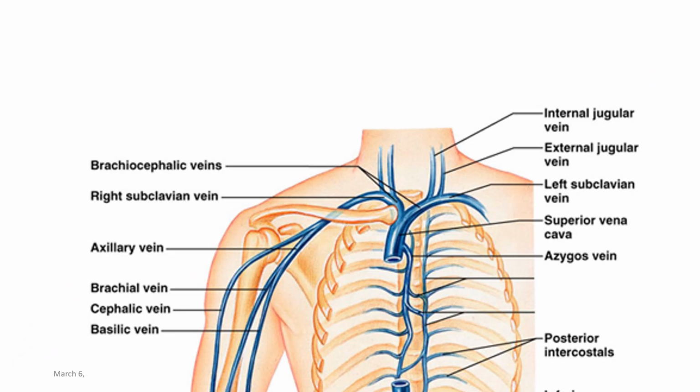Okay, now once you're done with your internal jugular vein, some site protocols will require you to also demonstrate the external jugular vein. This is a smaller vein to the lateral of your internal jugular. It doesn't fill as much, so it can be a little bit more difficult to identify, but you'd want to evaluate that external jugular vein in the same manner you did with the internal.